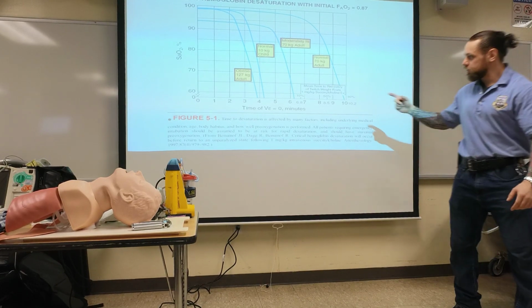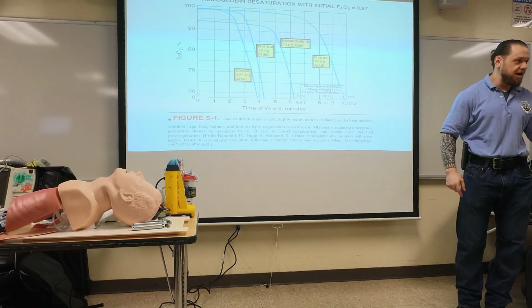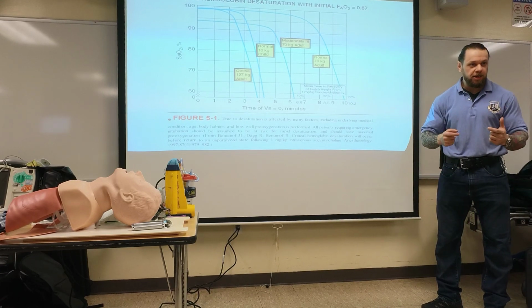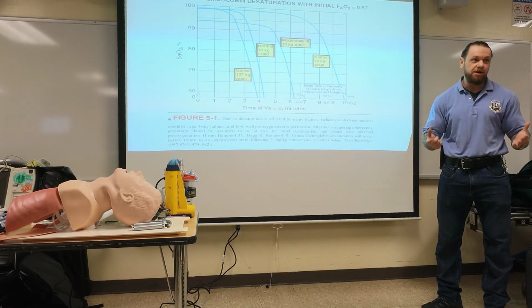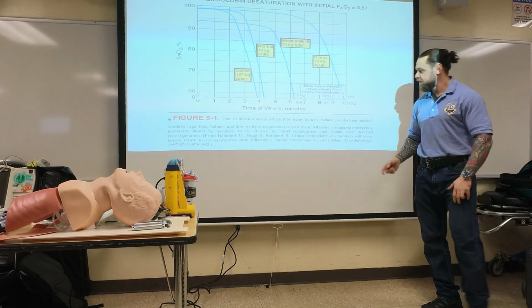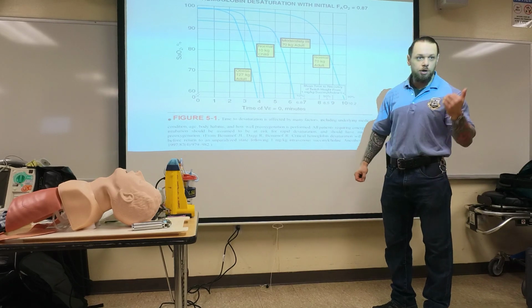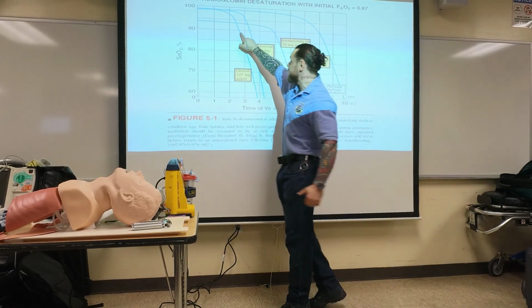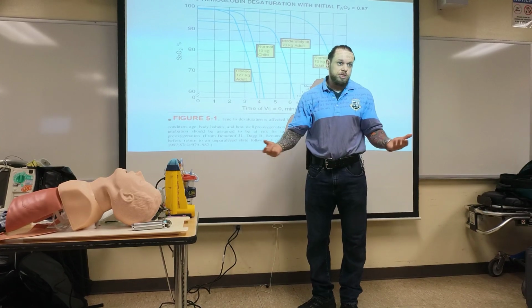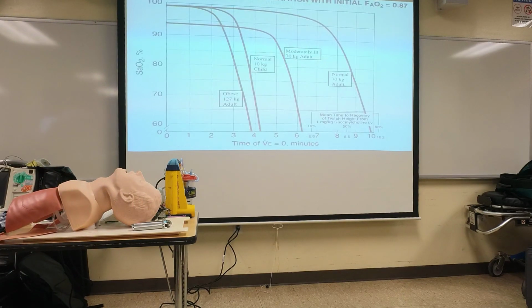Very good. So what they did was they took healthy guys, some sick guys, some fat guys, some kids. In anesthesia settings, anesthesiologists, who were trained providers in how to do the airway, gave them succinylcholine, and then they saw how long it takes for them to get to the 90 mark of desaturation, to know what the real time is. So let me blow up this picture so that you see, and then we're going to show you all these numbers.